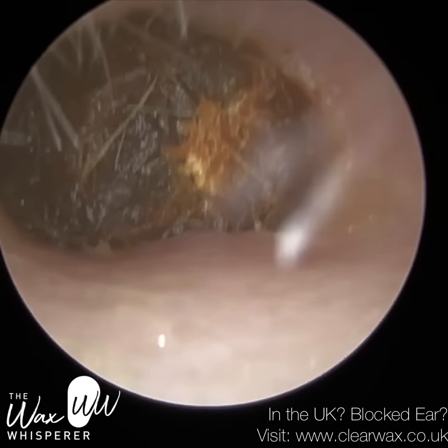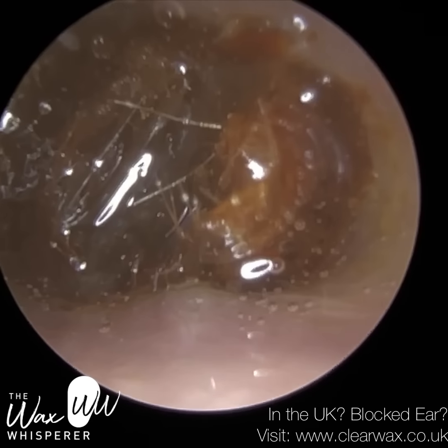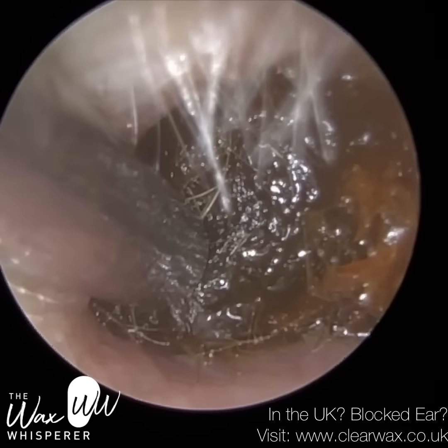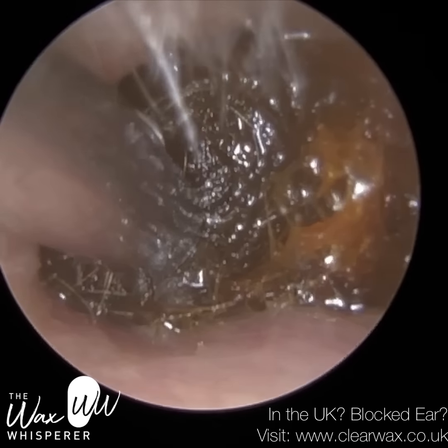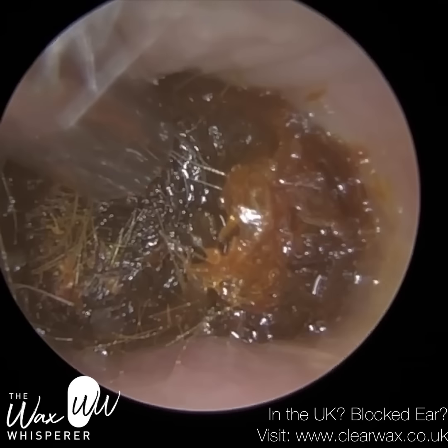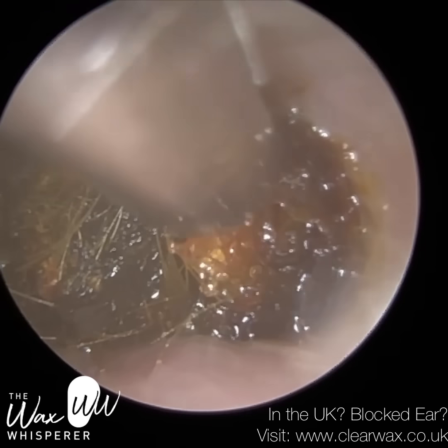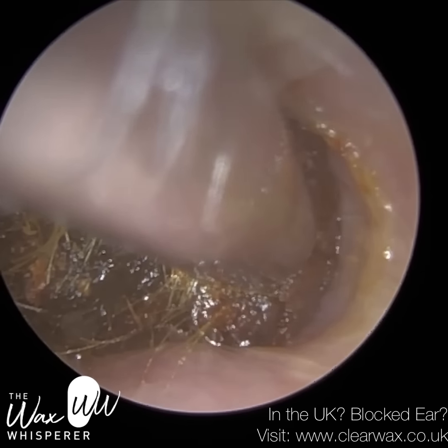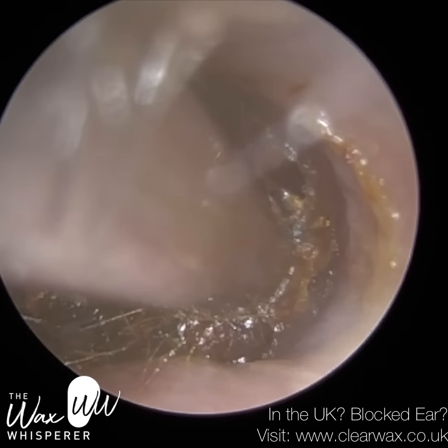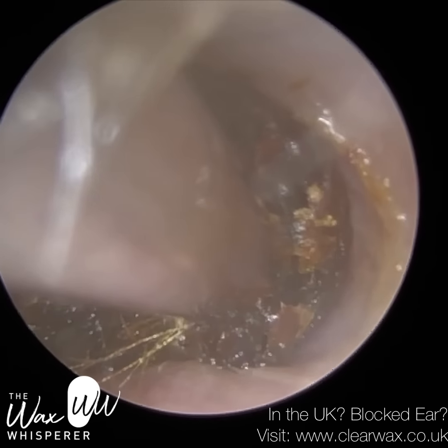And in the last couple of days, they're experiencing otalgia, which is earache. Initially, I didn't suspect this to be Keratosis Obturans. No, it is really immediately impacted. I can't remember if I mentioned, but they also admitted to using a cotton bud, and that didn't really help matters because it just further pushed it deeper and up against the eardrum. So initially, I just thought this was earwax, but as I was starting to remove this plug, it became apparent that in fact it was Keratosis Obturans.